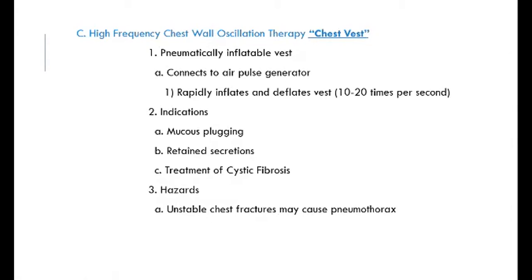See that? Mucus indications, mucus plugging. That pus and mucus just gets all sticky and stuck, and it retains secretion. Treatment of cystic fibrosis. Hazards may be unstable chest fracture. So if you got some broken ribs, it might crack and puncture your lungs. So you can't use it because it's going to squeeze your chest. All right, it squeezes your chest and shakes you like this. Okay?